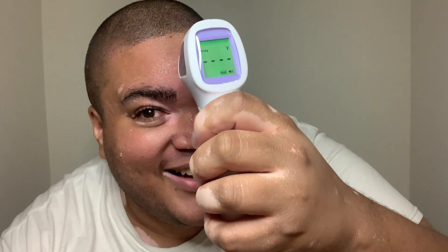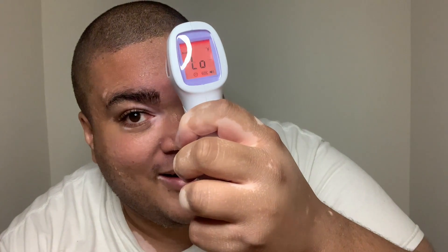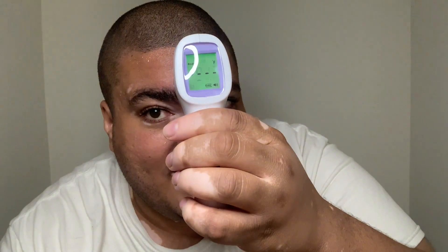Oh my god, it won't even record it. It's so cold. Let's try again. It's still too low. An ice cube to the face will render this useless. I'm going to wait about 30 seconds and then try it again. It's been 30 seconds. Let's see if this thing will read my forehead now. 91.7. Ice cube is definitely going to trick this bad boy.